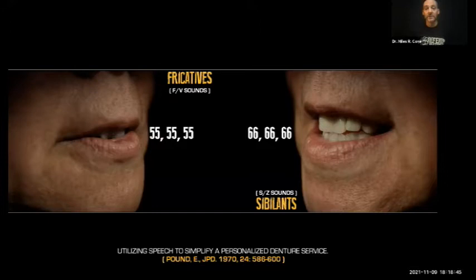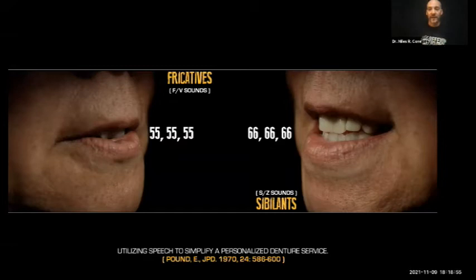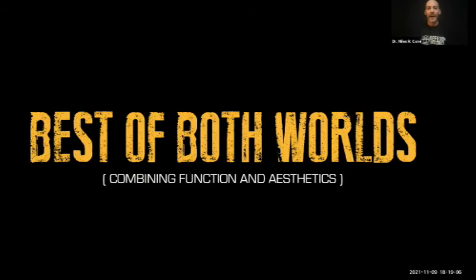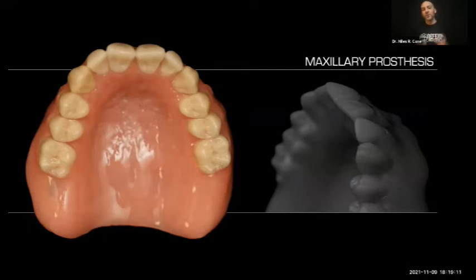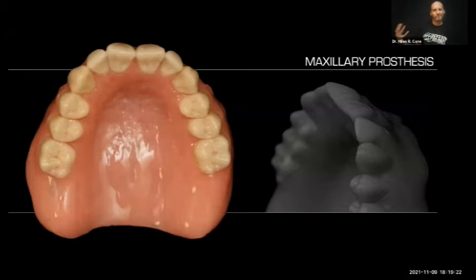In this photograph of Tran, when I'm having her go through all of her phonetics and speech sounds, the teeth are set in wax on that final denture base. Now I can really evaluate how does this look, how does it sound in the mouth — the phonetics and the aesthetics. I really feel like this combines the best of both worlds. When we look at the final denture, this was the processed record base, and now the teeth have just been reprocessed onto it.